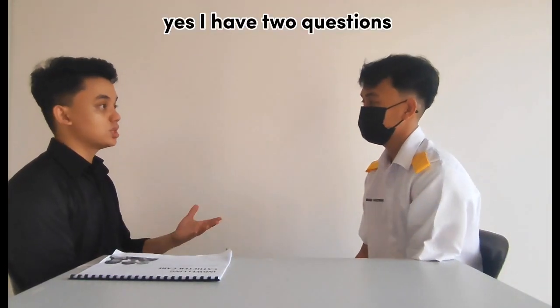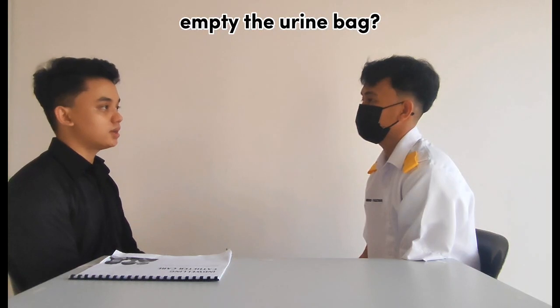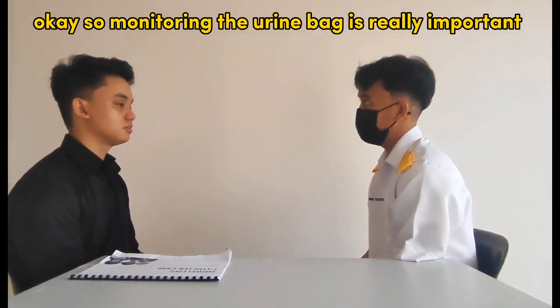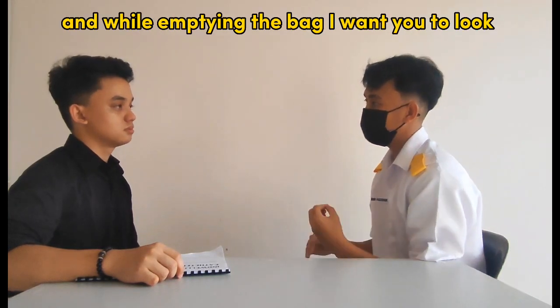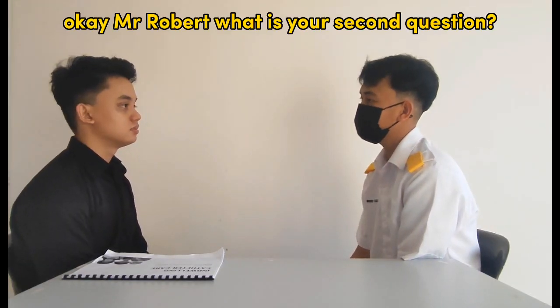Yes, I have two questions. So my first question is, how frequent do I need to empty the urine bag? Okay, so monitoring the urine bag is really important. So what you can do is that when the urine bag is already three-quarters full, you can empty the bag. And while emptying the bag, I want you to look for any signs of bleeding or any discharge inside the urine bag. Okay, Mr. Robert, what is your second question?